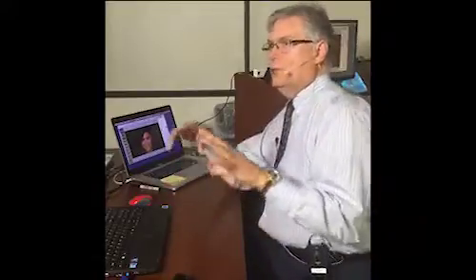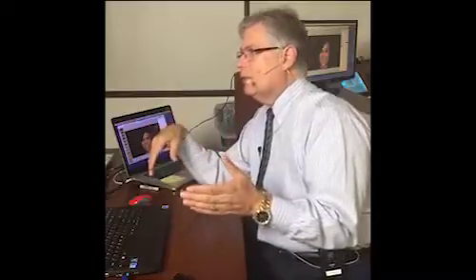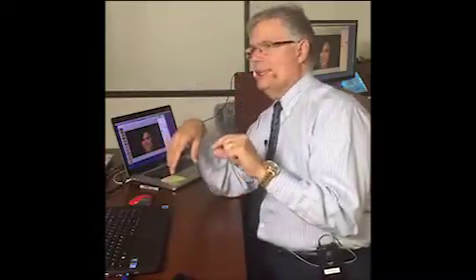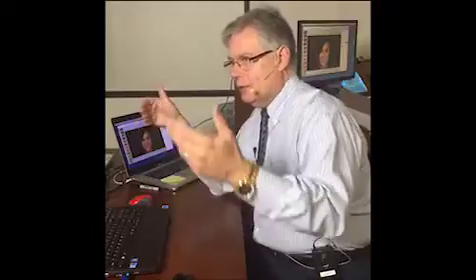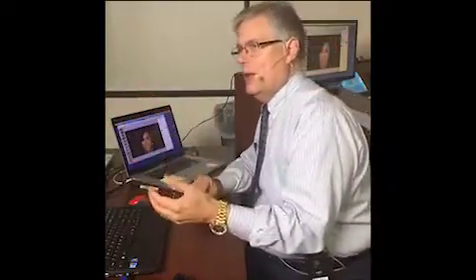And by the way, for those of you who are here and for those of you listening on Facebook, on your disk and in the Dropbox is a PDF with full written step-by-step instructions for everything I'm going to show you. And the reason I did that is that most of you don't operate a two-screen system. If you had two screens, it's real easy to put up a PDF and then do something. I don't know about you, but I have had the experience of going onto the computer and it's giving me directions to do something on the computer.